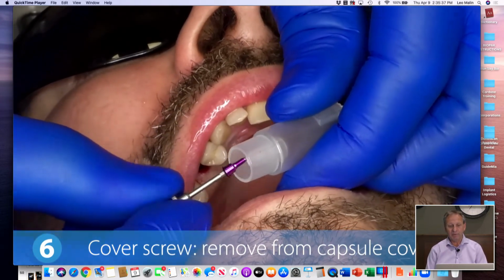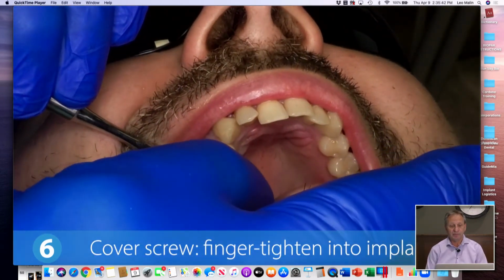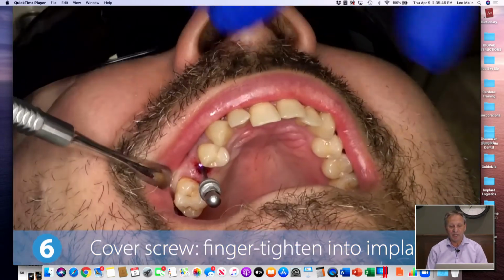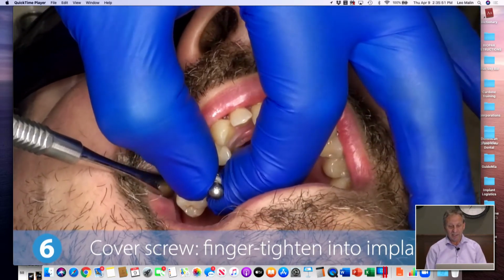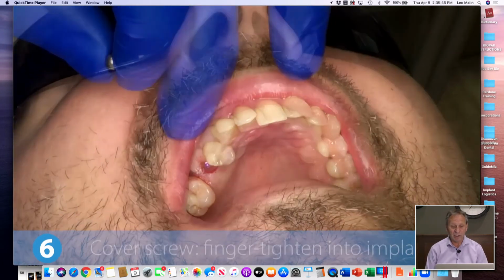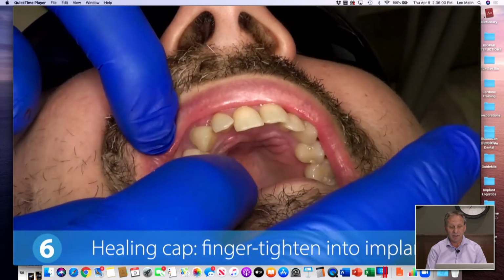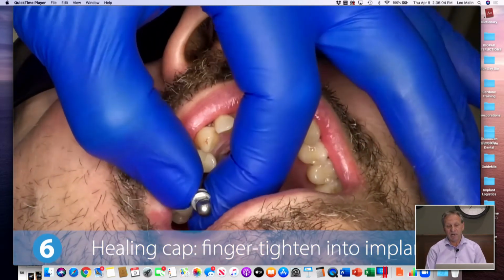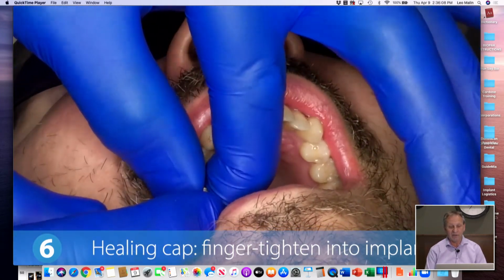This would be option one. This would be a cover screw. If you had poor stability of the implant, put the cover screw on, one miracle at a time, let the body heal and come back later and do the next steps. If you have good primary stability, you certainly could use a healing cap, which is what I think I show you here next. So that would require what we just saw, a second stage surgery. Here is your healing cap. If you want to avoid the second stage surgery, that would go on. If your decision today was to take the final scan, you certainly could do that. So you have all those options, obviously, that are still available to you.